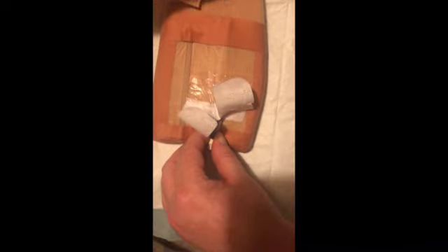And use your anti-adhesive swab to lift, back towards the incision site, all while maintaining your firm hold on the bung and the position of the cannula.